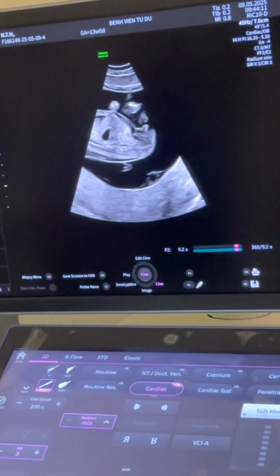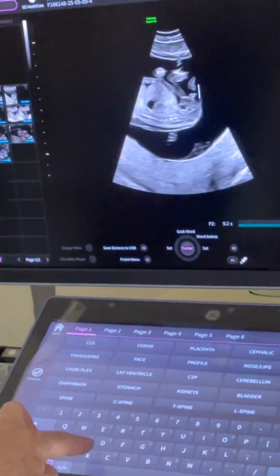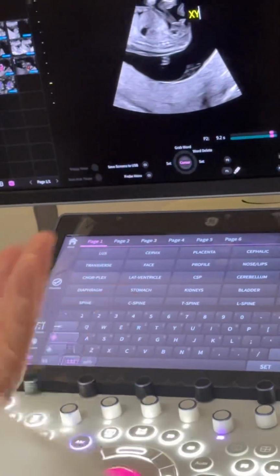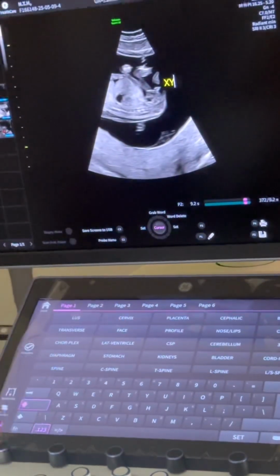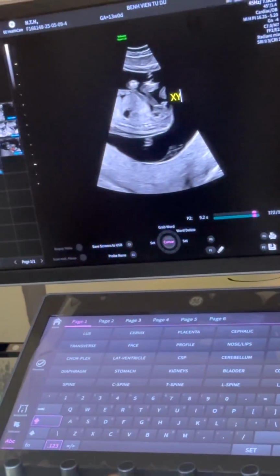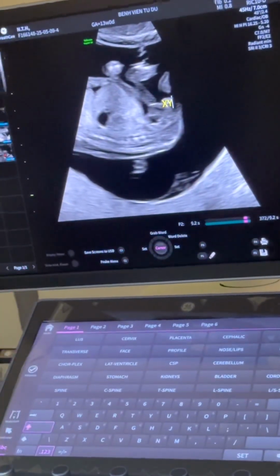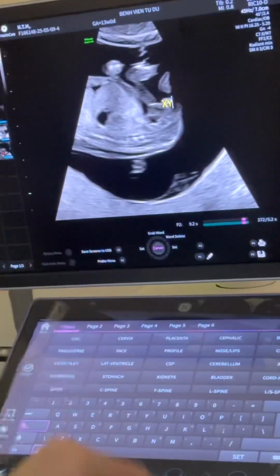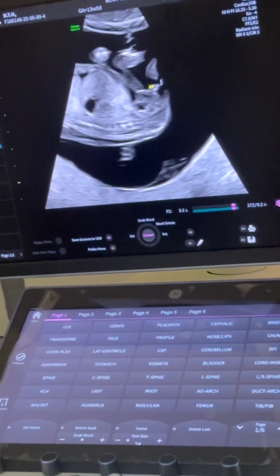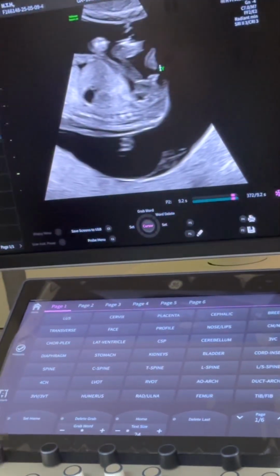But then this is the point where I can actually see what the genitalia is. So capture, this is the very important use of cine loop. Okay, so it just flashed by me. I may not be able to see it again. So freeze it and cine loop, magnify the image, because for us, we have NIPT results before the patient has a 13-week scan. And therefore, if I see that the NIPT shows that this was XX and I see XY, then I know I have a problem.